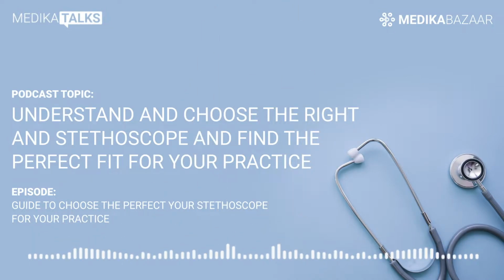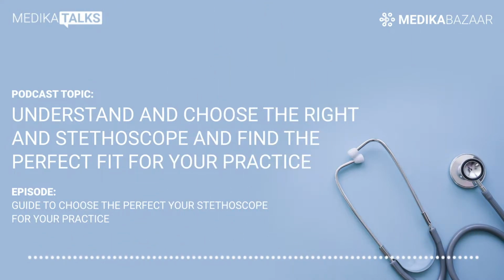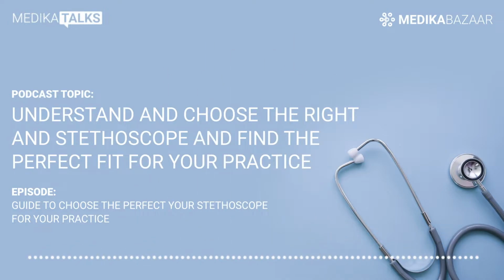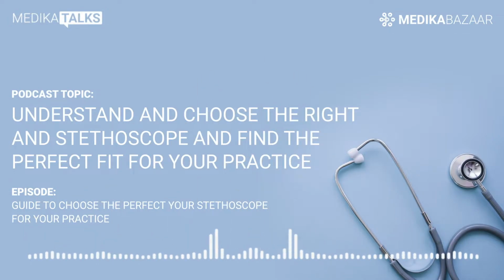patients. What are the types of stethoscopes available in the market? The following are the different types of stethoscope. Acoustic stethoscope. Acoustic stethoscopes are the most commonly found stethoscopes and are familiar to most people. These stethoscopes contain two hollow tubes which are connected to a chest piece and work through the transmission of sound. The chest piece can transmit sound through both the tubes.